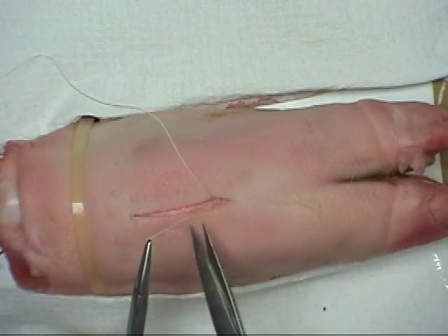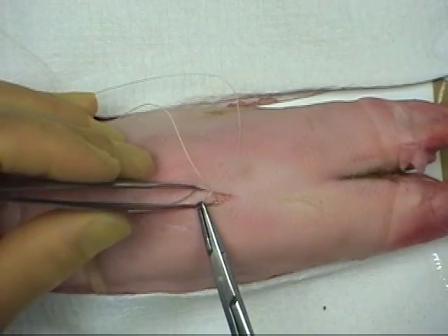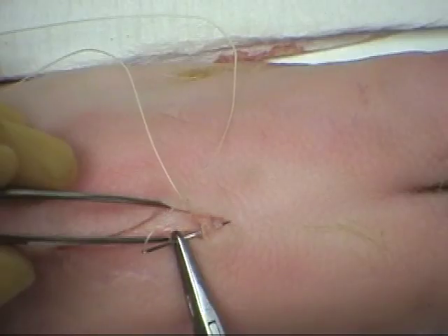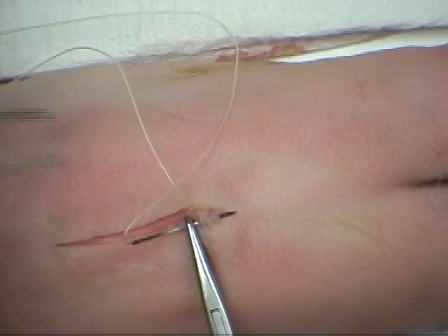The tail should be divided as close to the knot as possible. The long length of suture must now be passed from deep to superficial at the apex of the incision.